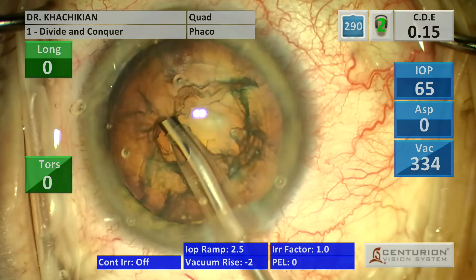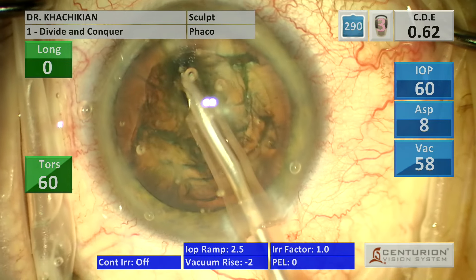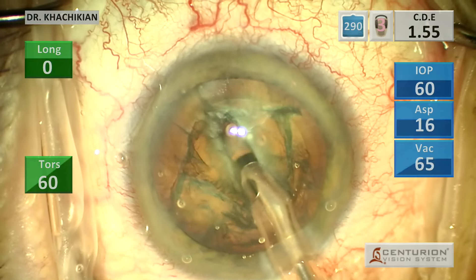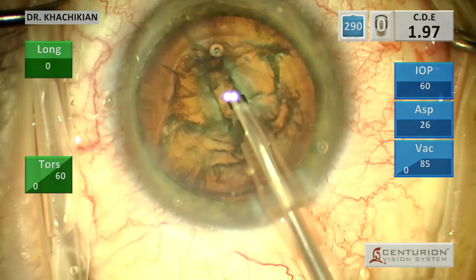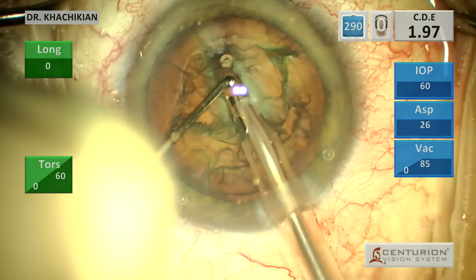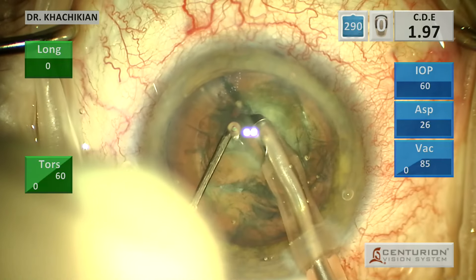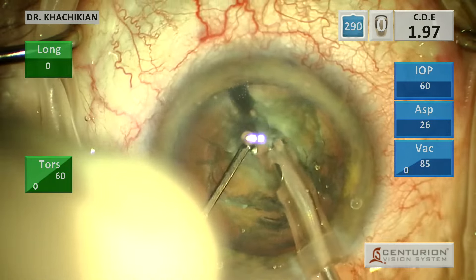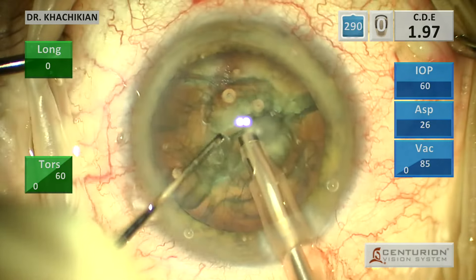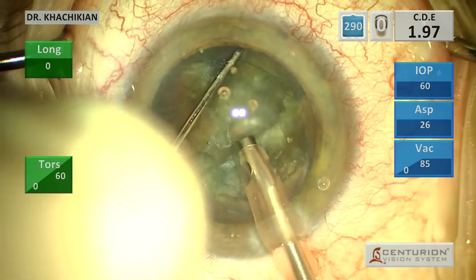Let's see how dense this is. We'll clear off the central cortical material — that's pretty dense. You're pushing the lens around; you don't want to do that too much. Get a couple of scoops, get a little purchase. Density is something you have to get used to. It's dense enough so that even though I didn't sculpt very far, it's going to kind of crack. Sorry for having my finger there on that second instrument in the way of the view.